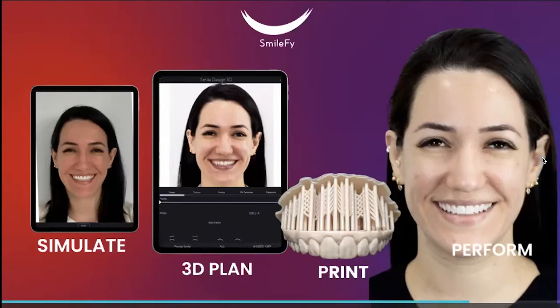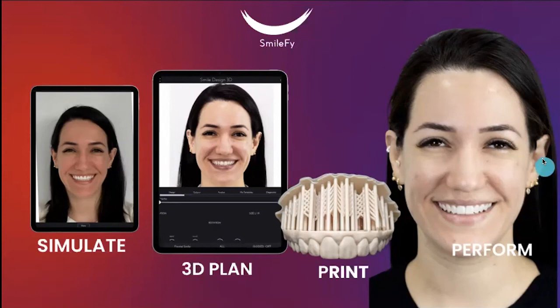In this case, the patient selected the version with the gingivectomy and the veneers, and the final result was that the patient now can smile with more security, and she is now referring a lot of new patients because she was able to receive the best experience.